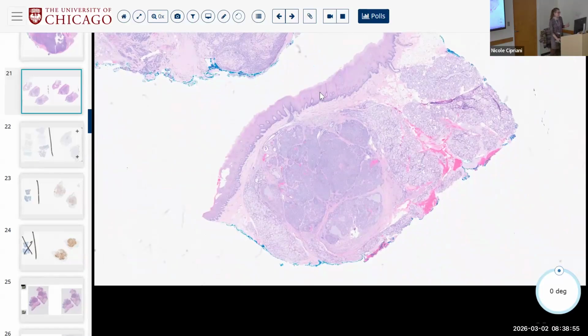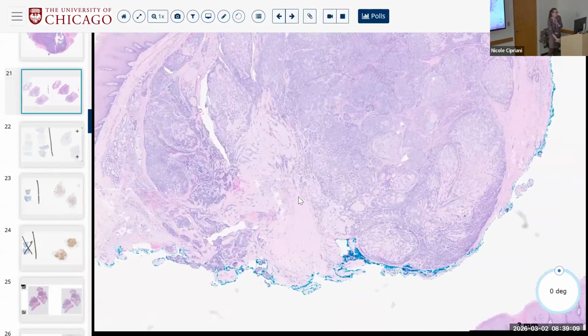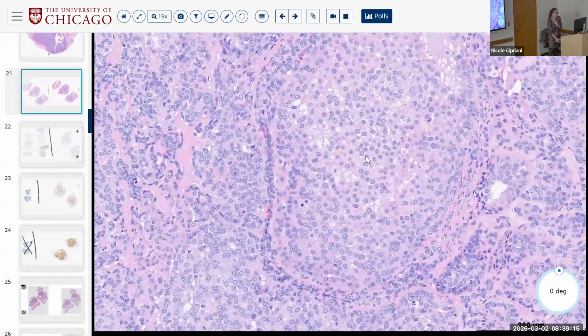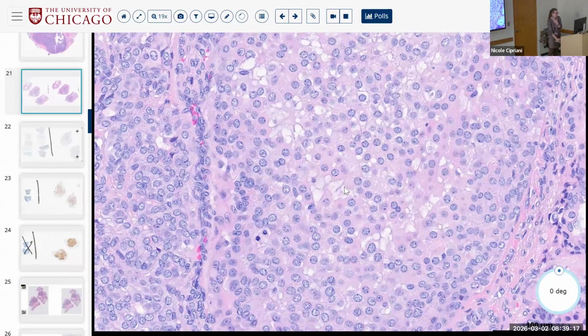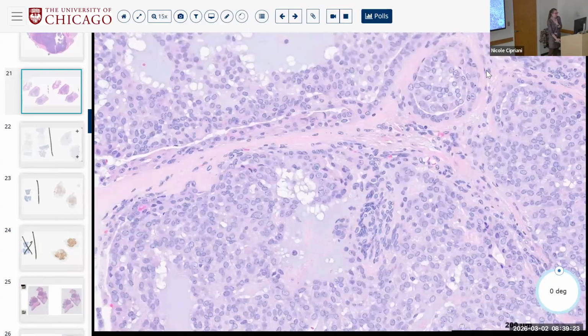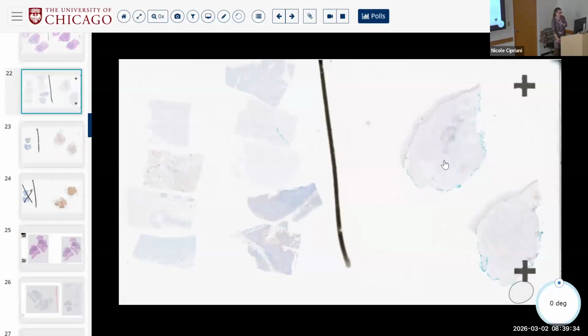So I kind of think of it as cloud-like, right? There are these large, voluptuous kind of nests that are almost cloud-like, and the stroma is this very pale pink, pale blue, pale purple, and the cells themselves are very monotypic. There's a mitotic figure with this kind of open chromatin. And in the areas of ducts, I'm not 100% convinced that I see those nice 2 cell types. So in that case, a monophasic neoplasm of the palate is very likely going to be something like polymorphous.